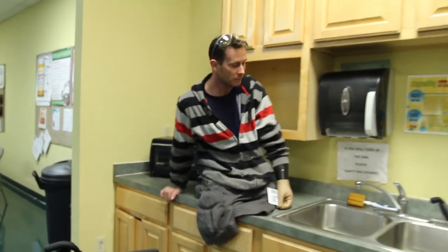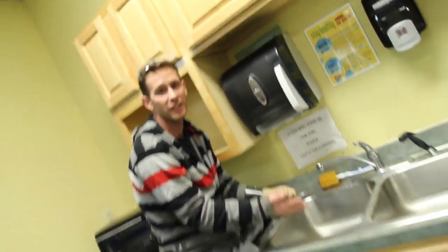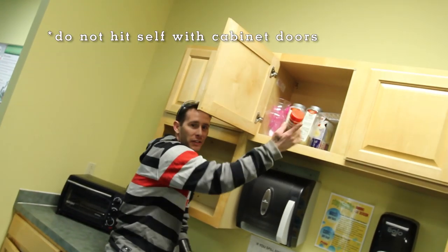Just like that. Come up, do your dishes, whatever you need to do, grab your cabinets, whatever — get all your top shelf stuff, reach everything.